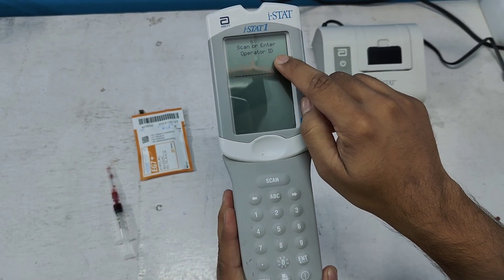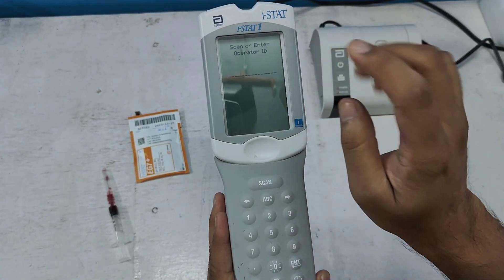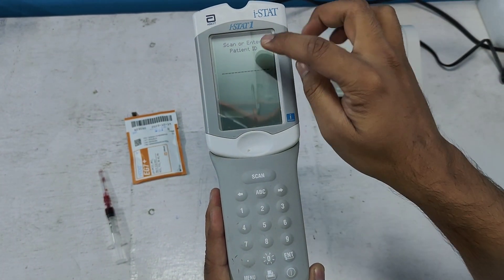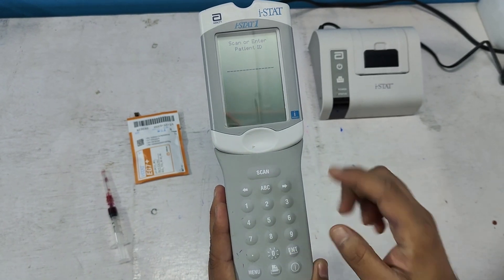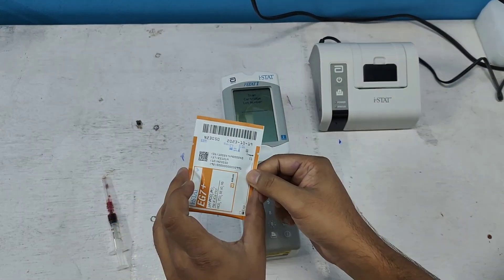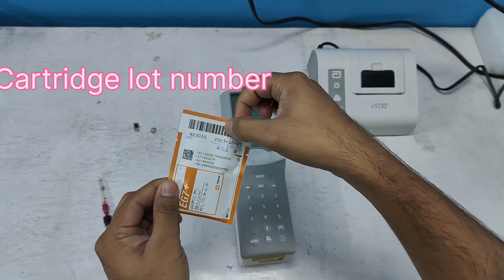The prompt says 'scan or enter operator ID.' I am skipping this — I don't want to put an operator ID, so I press enter. Next it says 'scan or enter patient ID.' I am not giving the patient ID, so I skip it by pressing enter. Then it says 'scan cartridge lot number.' Here is the cartridge with the lot number barcode that we need to scan.